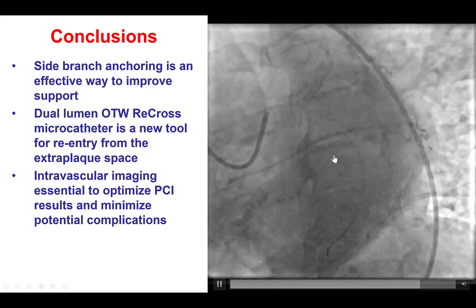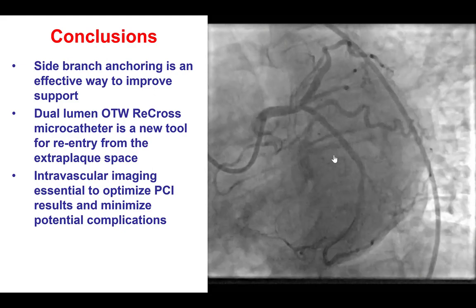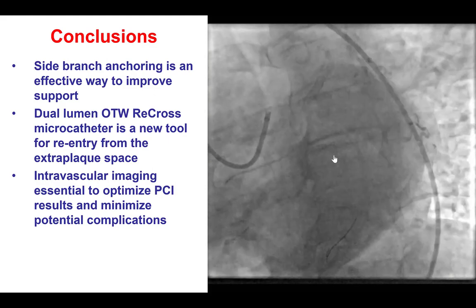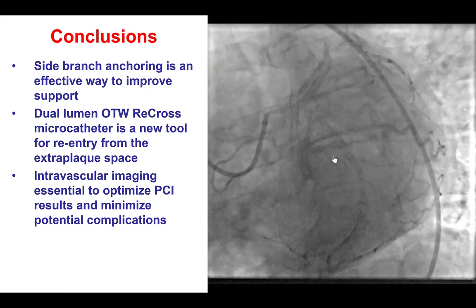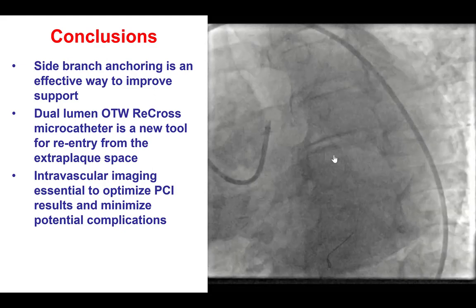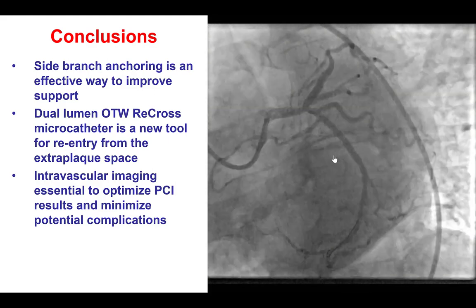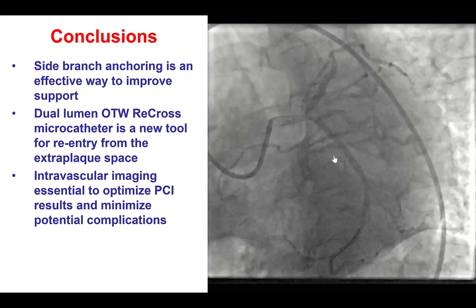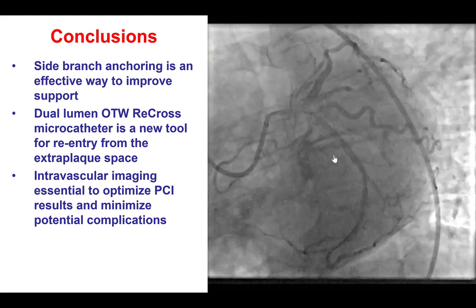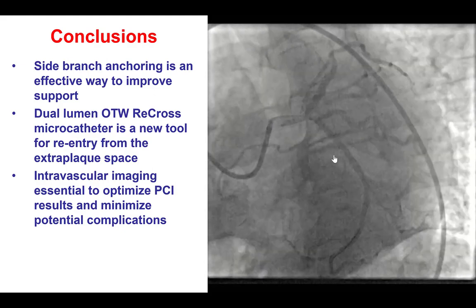The third lesson is that for re-entry, one additional option to the Stingray is to use the Recross dual-lumen microcatheter. The advantage of the Recross compared to the Stingray is that it is more deliverable. The disadvantage is that orientation may not be as well established as the Stingray, which has a balloon that helps orient the catheter with one surface facing the true lumen and the other surface facing the adventitia. Nevertheless, in this case, we were able to use the Recross to cross through this balloon-uncrossable lesion and successfully re-enter into the distal true lumen.